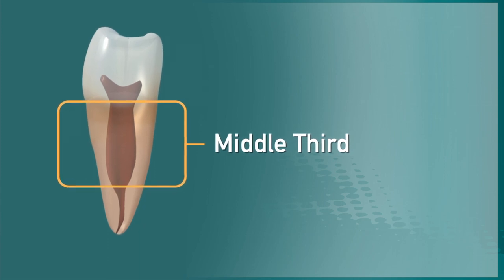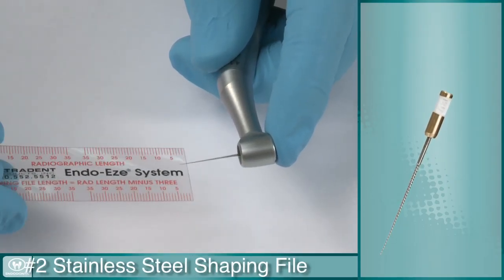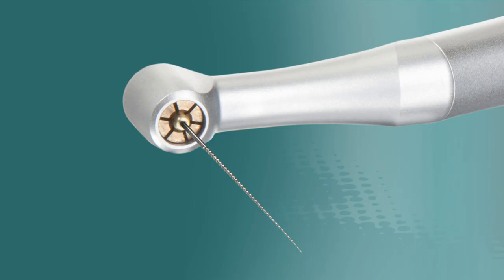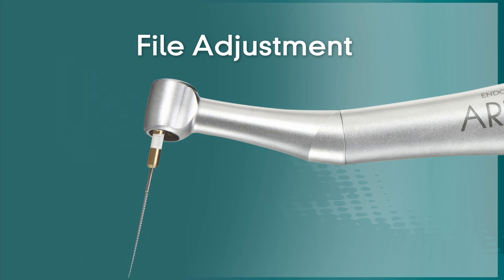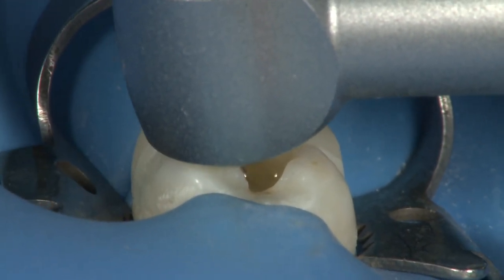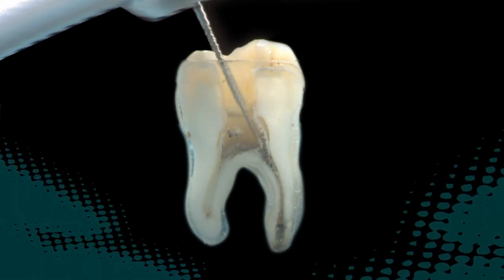You are now ready to begin instrumentation of the middle third of the canal. Move from the number 15 hand file to the number 2 shaping file. Place the number 2 stainless steel shaping file into the EndoEase Arios Contra Angle and set it to working length using the adjustable head and EndoRuler. This contra angle features a 30-degree reciprocating motion that allows instruments to follow the natural anatomy of the canal wall while greatly reducing the risk of file separation. The unique chuck allows files to be adjusted by plus and minus 4 millimeters. Apply lateral pressure and a side-to-side brushing motion, gently cleaning the canal for approximately one minute, cutting on the upstroke.